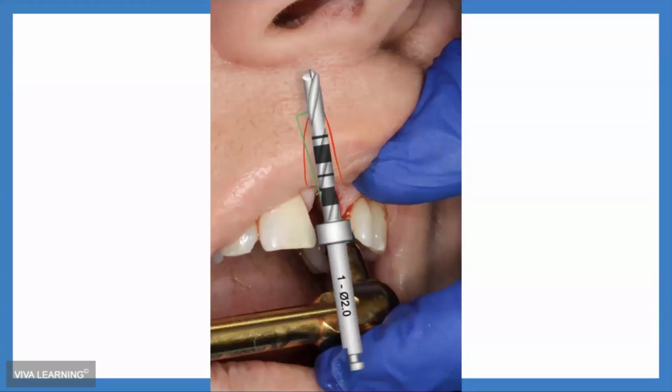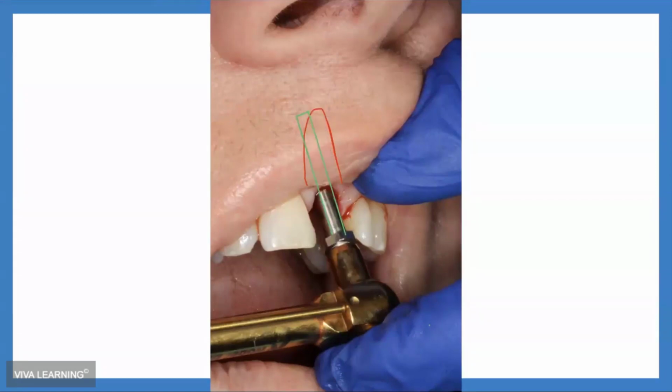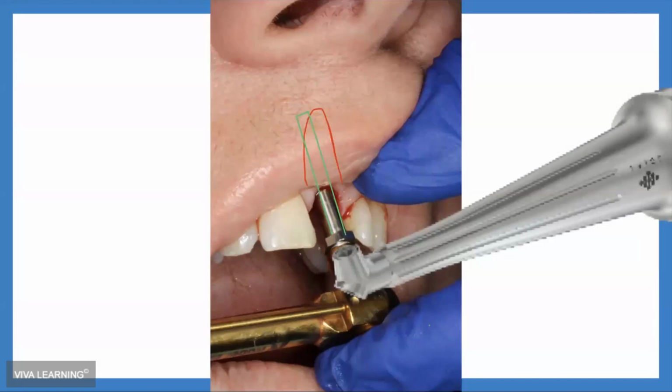And I've really struggled with immediate placements and have shied away from doing them in the past because of this very problem right here. I would rather let the bone heal completely for 3, 4, 5 months, and then go back into a pristine site and have less issues with the deflection. But I'll show you nowadays, this is kind of more what I'm doing. I'm bringing my laser in through a guide. I'm shooting a laser beam straight, and of course that laser beam does not deflect.